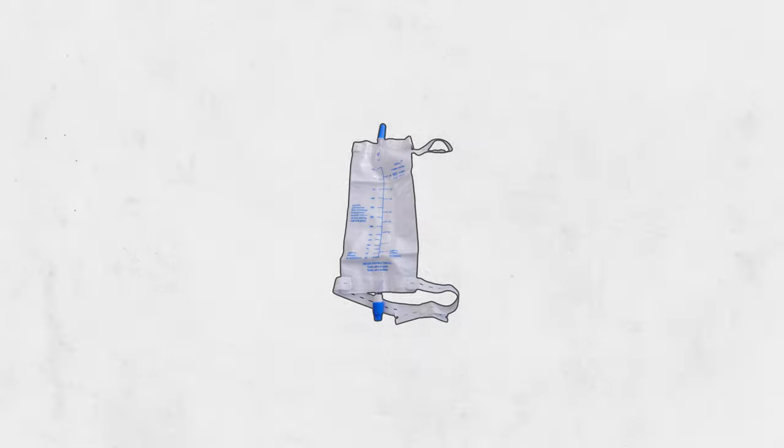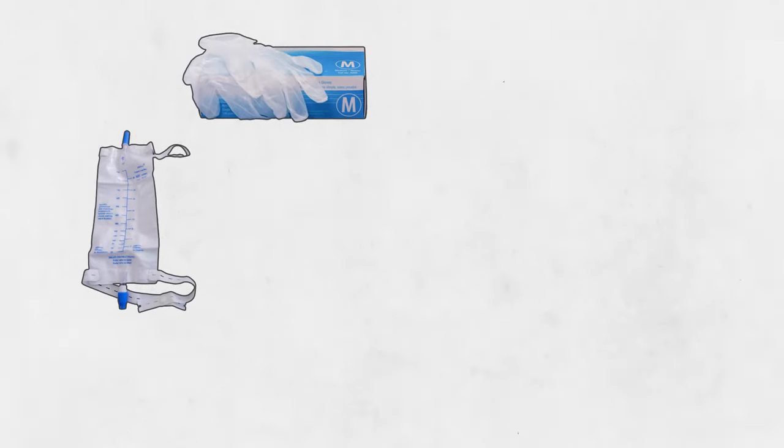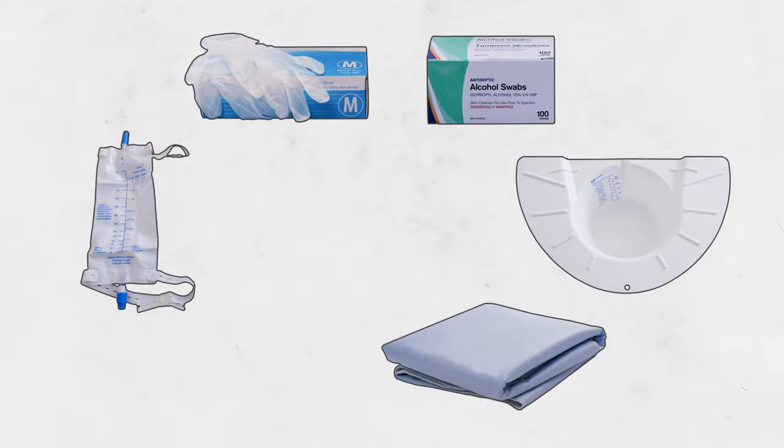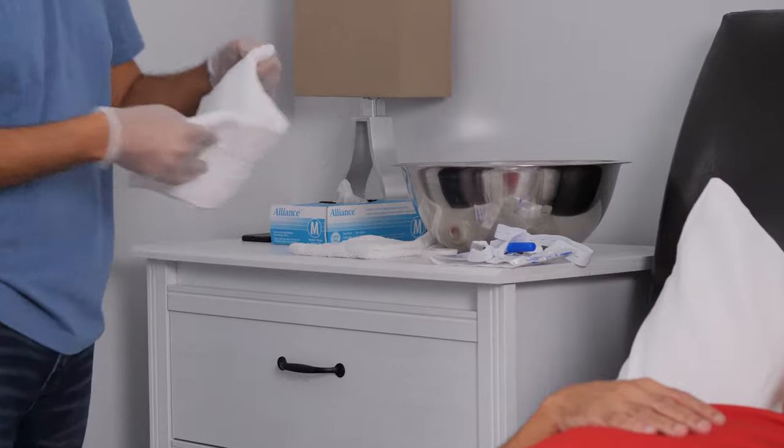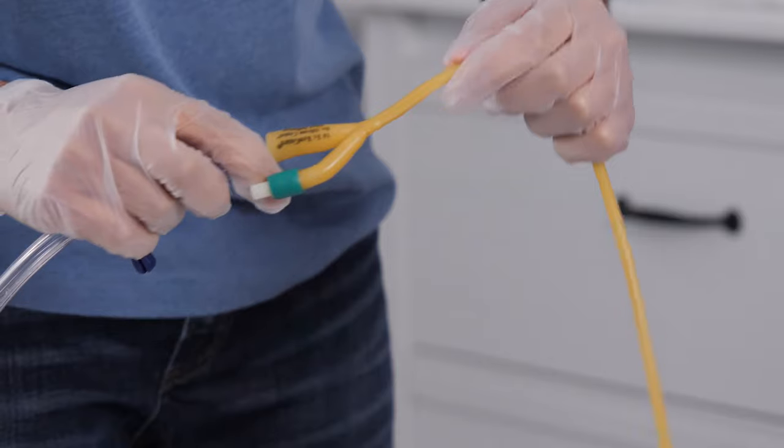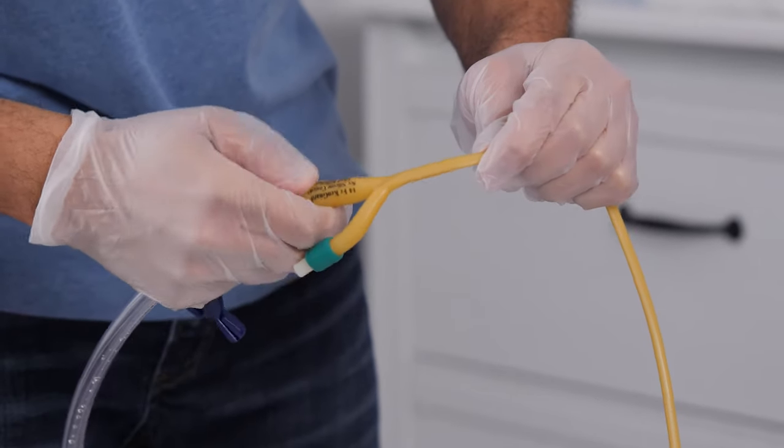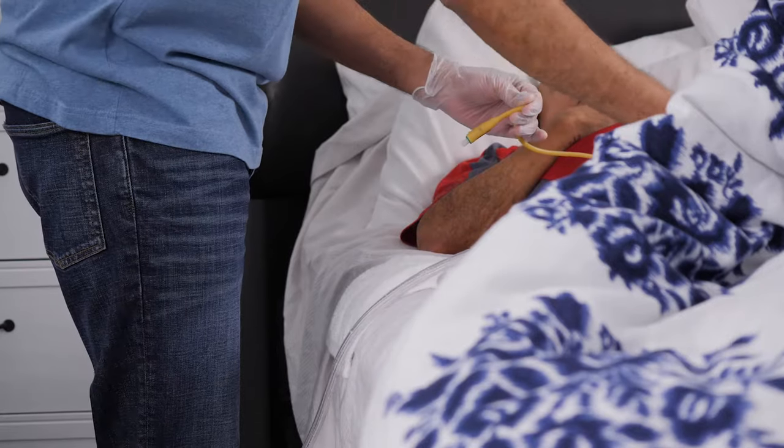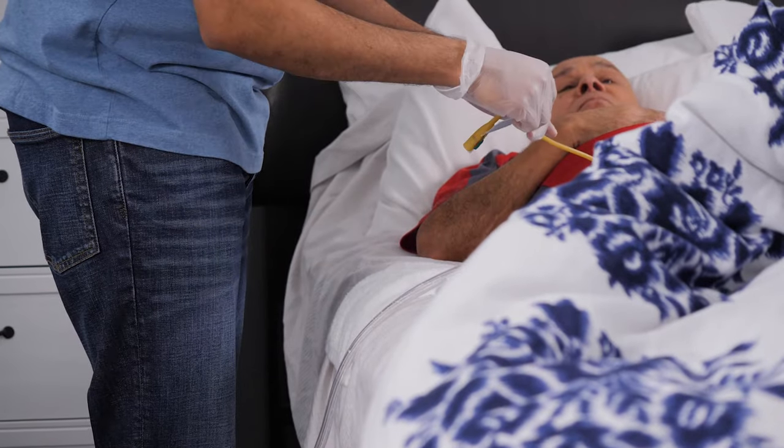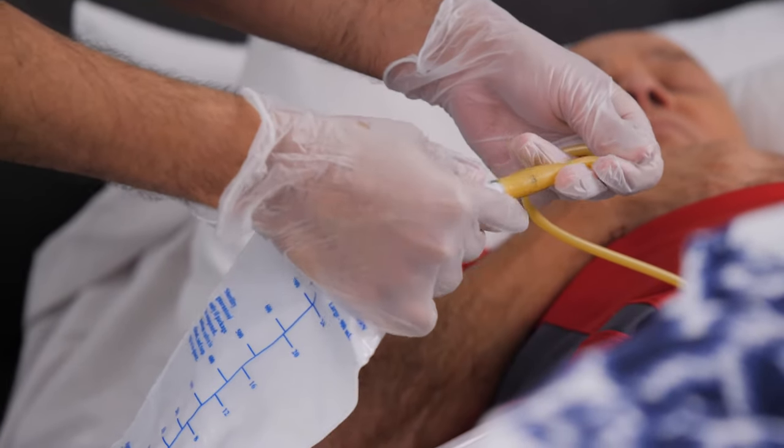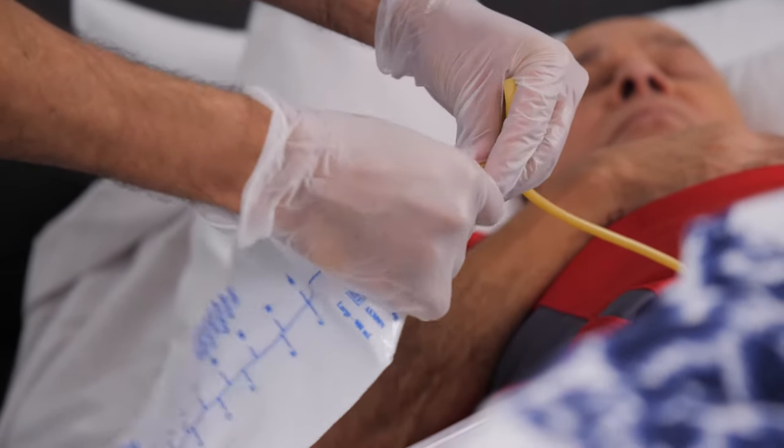To change the bag, you'll need a clean drainage bag, gloves, alcohol wipes, a container to drain urine into, and a waterproof pad or towel. Let's try it. After emptying the bag, place a towel, cloth, or waterproof pad under the connection between the catheter tubing and the bag tubing. Have your new bag nearby, then pinch the catheter tubing and carefully disconnect the catheter from the old bag. Wipe the catheter tube with an alcohol wipe and connect the new bag. Set the old bag aside to clean it after.